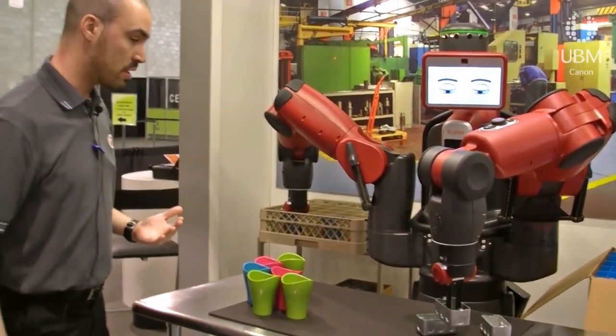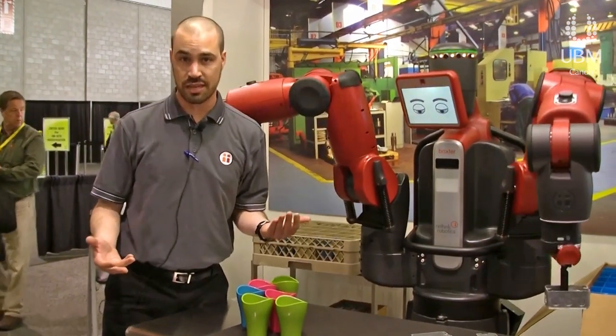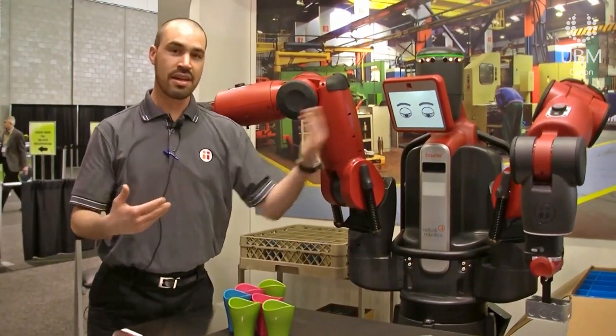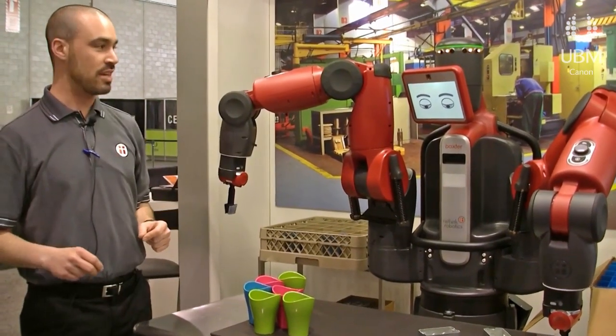Talking about safety, one of the nice things about Baxter is that I can be in the way — because I'm a clumsy human and I might not know that Baxter is going to get in the way. As it bumps into me, we get some visual feedback that I am in the way, and it just gives me a little nudge and keeps working.